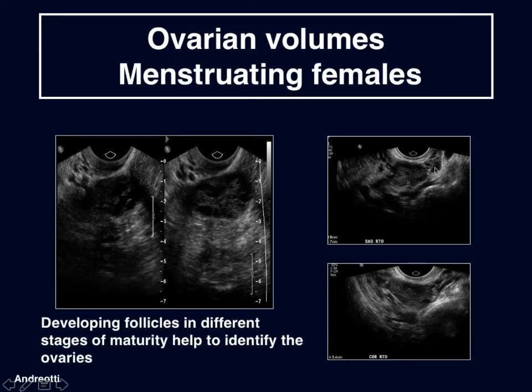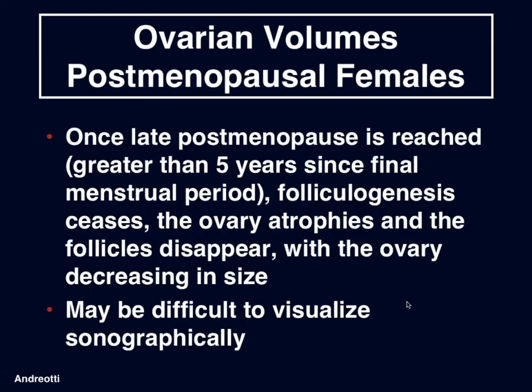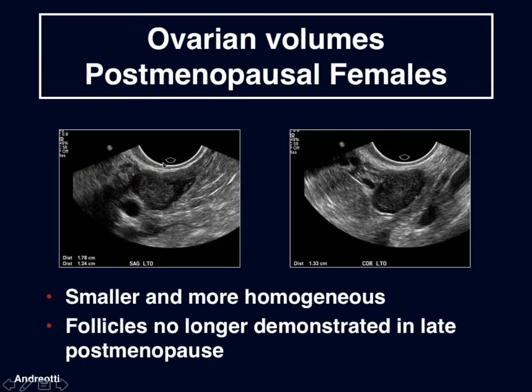Here are the ovaries with little tiny follicles. In postmenopausal females, once late postmenopause is reached — considered greater than 5 years since the final menstrual period — folliculogenesis ceases, the ovary atrophies, and the follicles disappear with the ovary decreasing in size. It may really be difficult to visualize these ovaries sonographically. Here we see a more homogeneous appearing ovary in sagittal and transverse views, and what you can note is that follicles are not present — this would be a patient in late postmenopause.